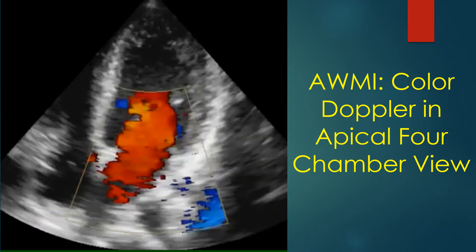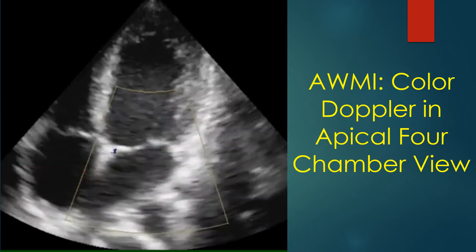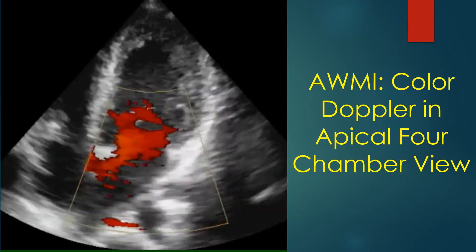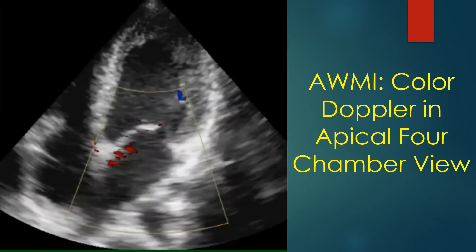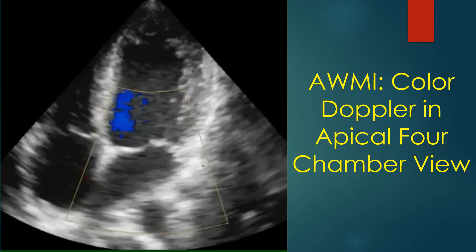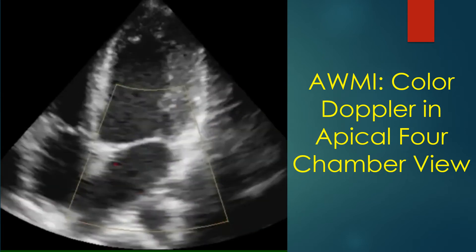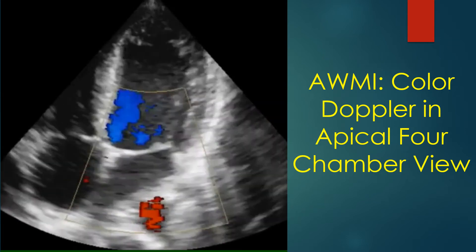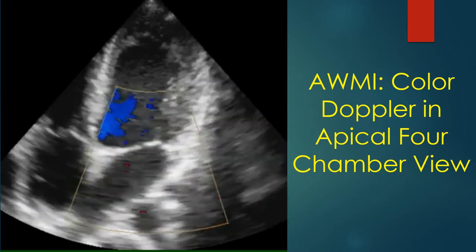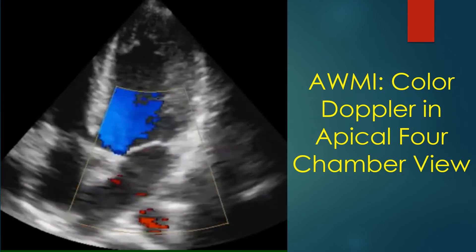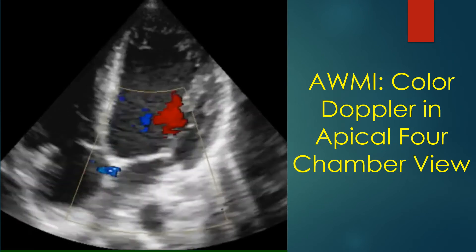Colour flow imaging in apical four-chamber view. The red flow is diastolic mitral flow towards the transducer, and the blue flow is away from the transducer towards the left ventricular outflow tract.